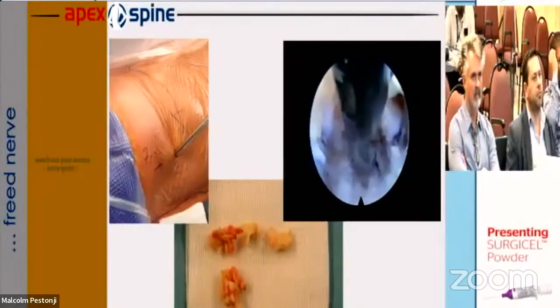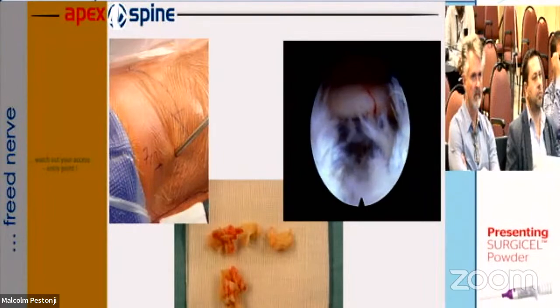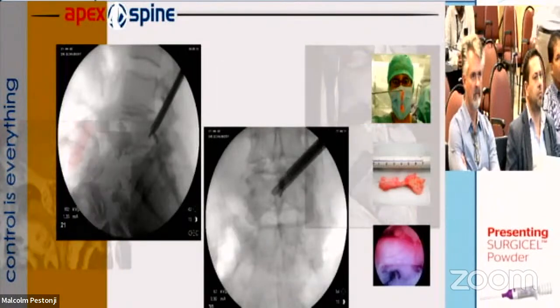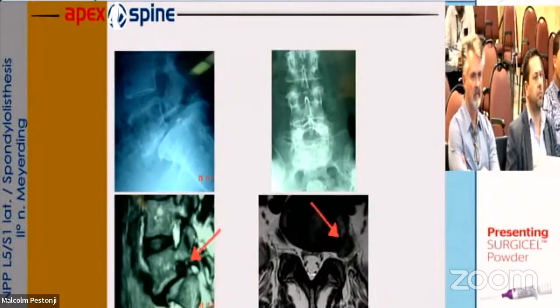Again, the approach, 7 centimeters lateral, processus articularis of the lateral facet joint. And here, far caudal sequestrated disc herniation L4-5. Also here, nice removal. Yes, perfect.